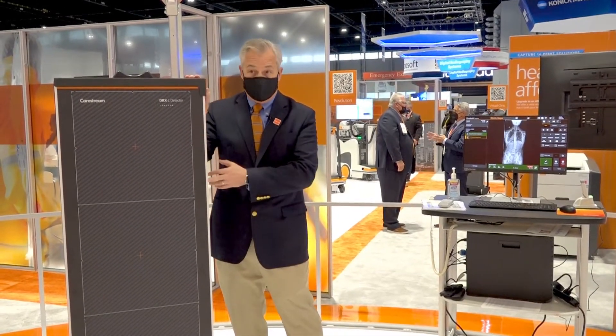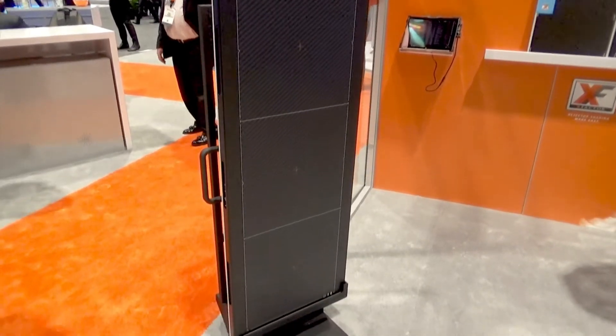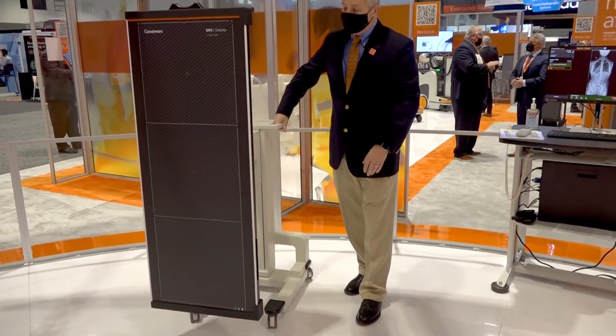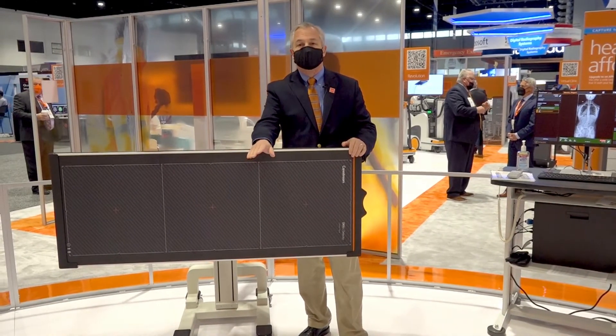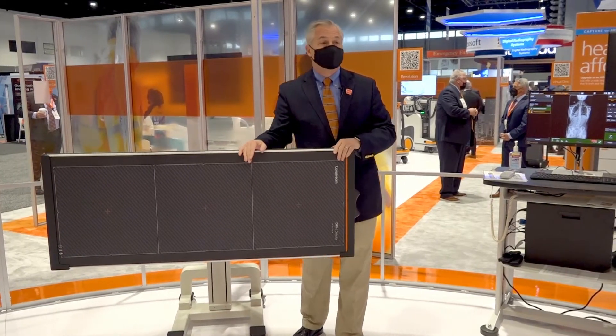One is the detector — there's a removable grid here. We have a fixed stand, and we also have this portable stand on wheels. The advantage of this portable stand is you can rotate the detector and flip it up and put it under an operating room table, which allows you to take it into the OR and do some shots there.